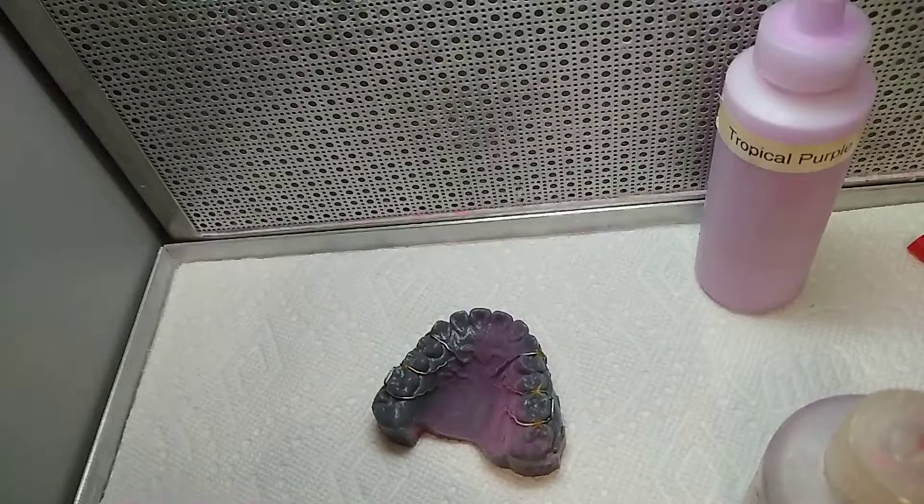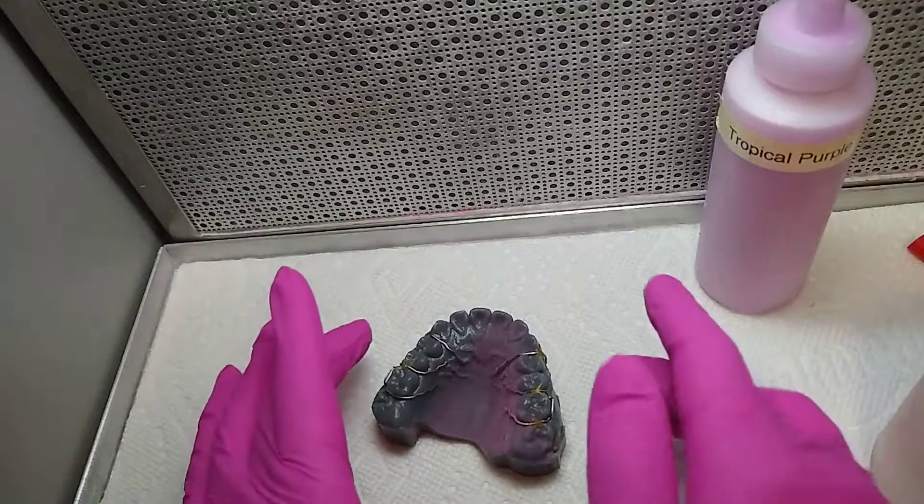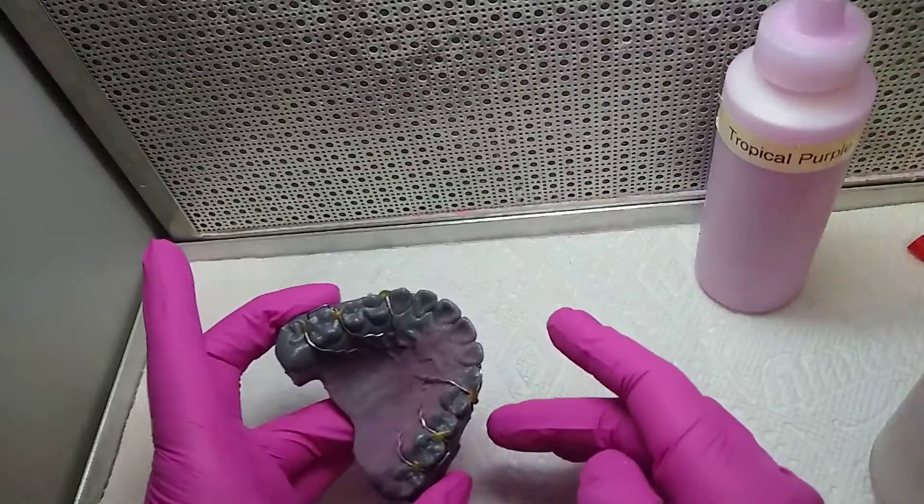First, you have to block out all unneeded undercuts if necessary, and back it up with wire to the model. Then you have to put the separator. I did all of this and I'm ready to pour acrylic.